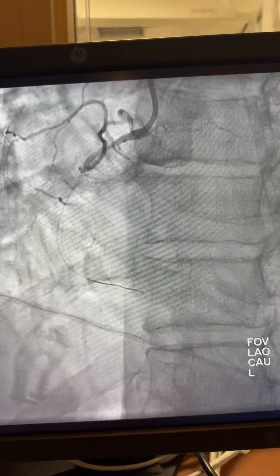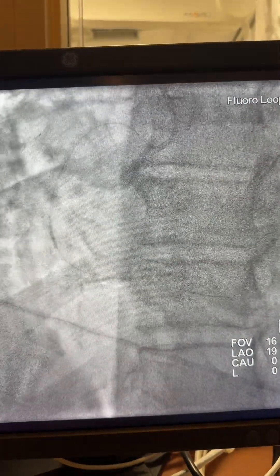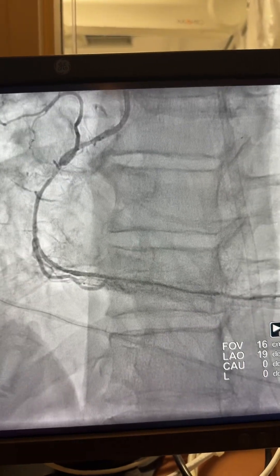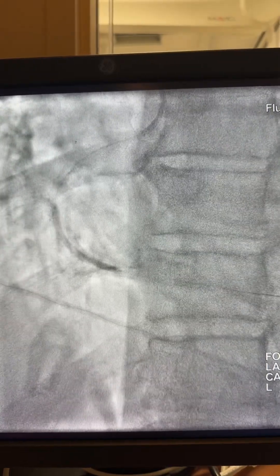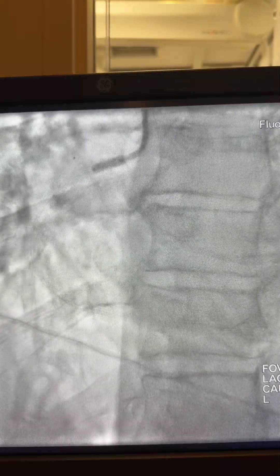First a 1.25, then 1.5 balloon. After that you can see the true lumen. Giving IC nitroglycerin, then a 2.0 balloon. After that you can see where to place the stent — 2.75x38, 3.0x38 — and then the last stent.